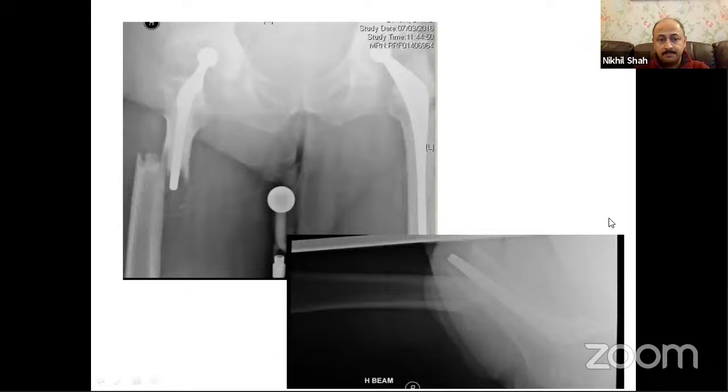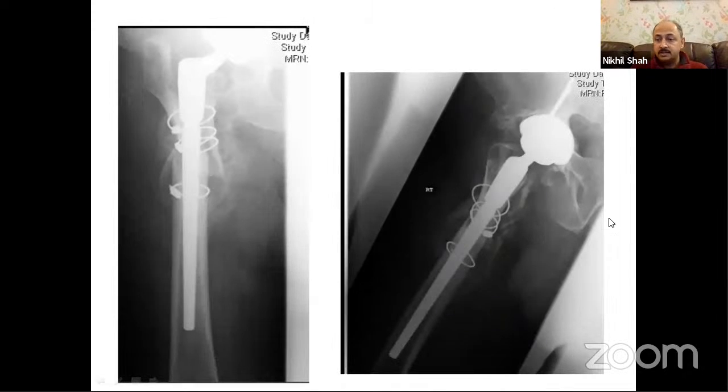This was another example of a very well-fixed Charnley stem with a transverse type fracture near the tip of the stem. And I think Sanchit showed one of these cases where they chose to fix it because it's quite traumatic sometimes to take that cement out from the fractured proximal femur. In this case, the surgeon, this case was done in another hospital. He chose to take the cement out and do a long uncemented stem, but unfortunately encountered some problems.